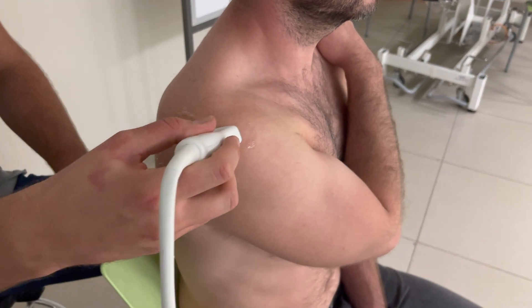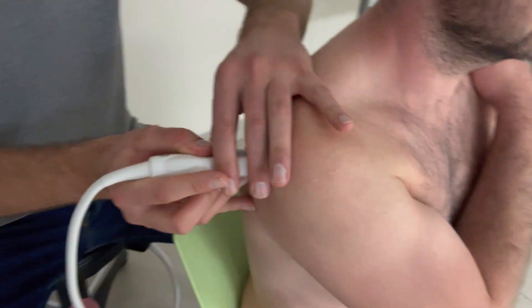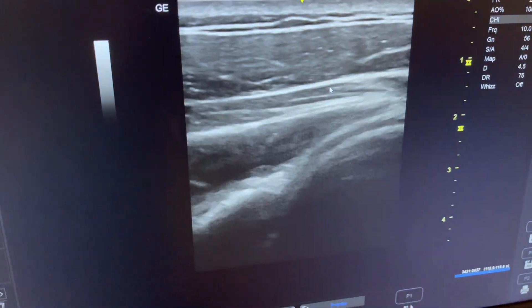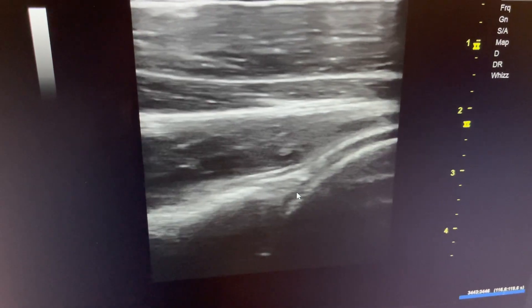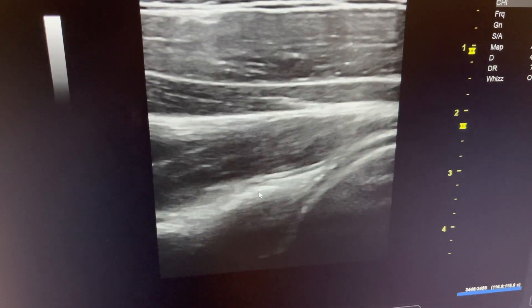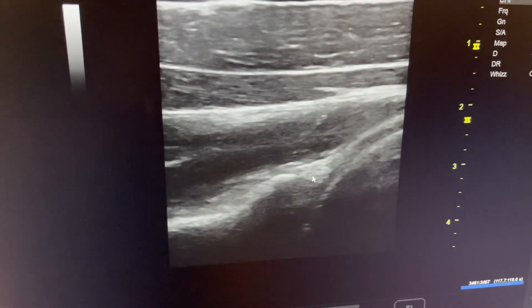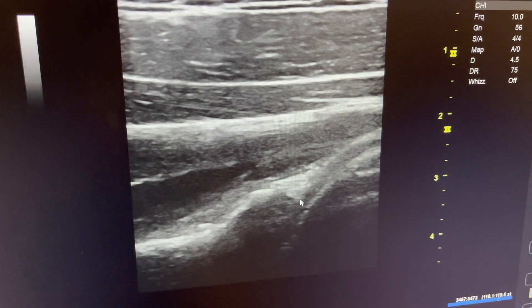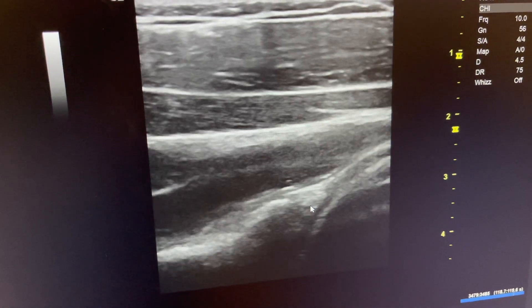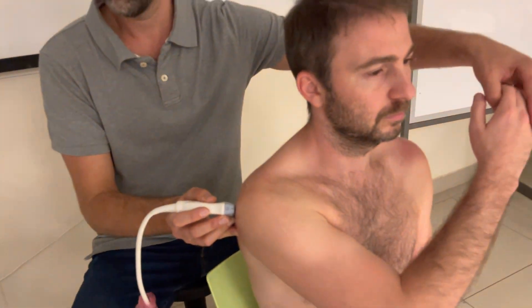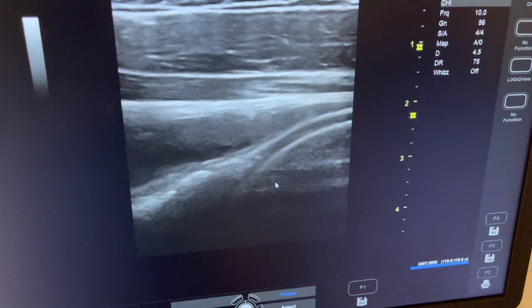The probe will go more or less in this direction. Let's look at the image. We start here at the place where we see the humeral head — that's your first landmark. We go a bit more medial and we see the bone of the glenoid, and next to the glenoid is a hyperreflective structure that actually lets sound beams through, so it's not bone. This is the labrum. We see a very nice triangular shaped structure, and if we do a little dynamic maneuver like this, we can see on the image that the labrum stays in place.